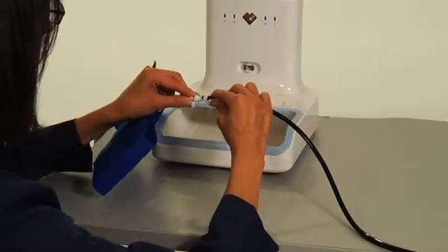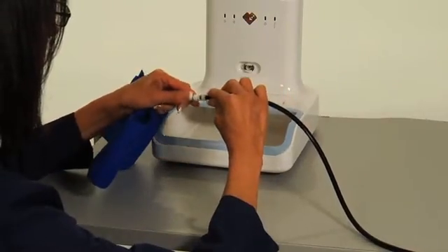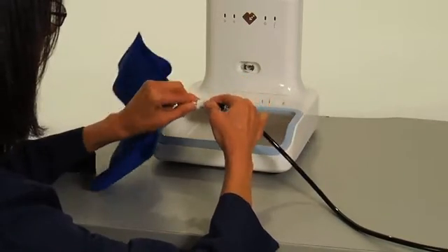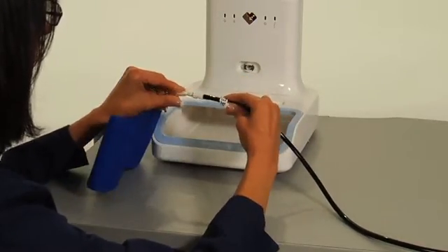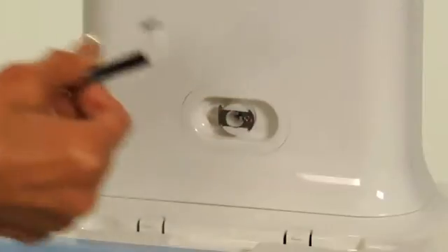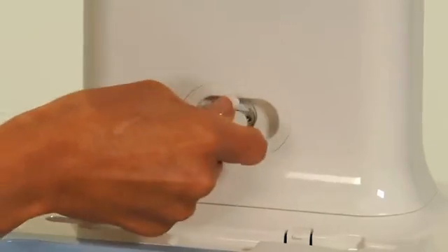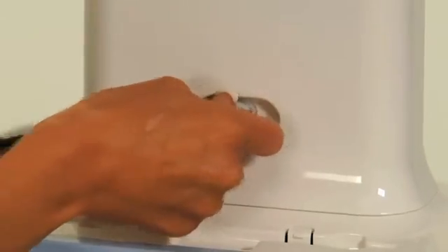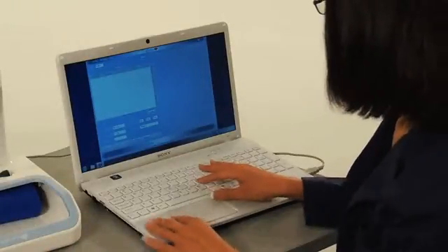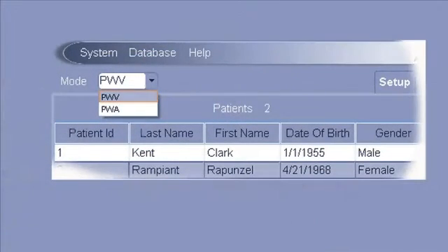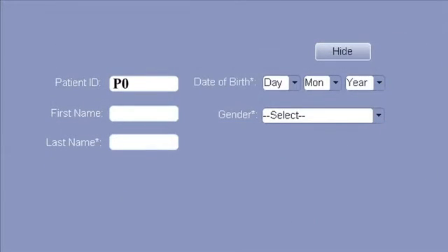Connect the cuff to the cuff tubing, making sure that the connection is secure. Connect the cuff tubing to the SphygmoCor Excel device. Select PWV mode and enter the patient data.